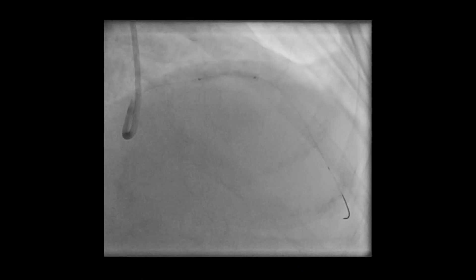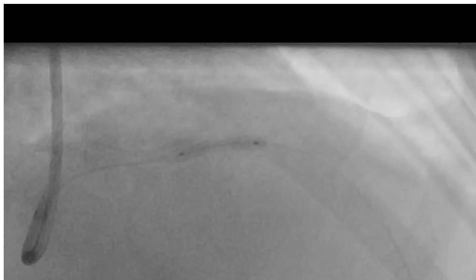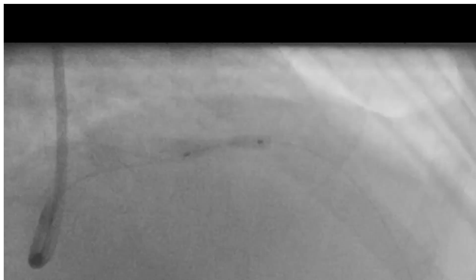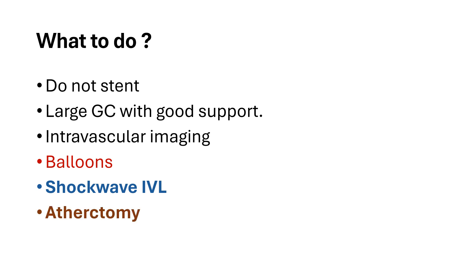Pre-dilatation was done using NC balloon 2.5 by 20, and then 2.75 by 15 to high pressure. There was still waist at the mid-part of the balloon, presenting a balloon undilatable lesion. We have a short video on this topic. In short: it is preferable not to stent immediately; use a large guide catheter with support, intravascular imaging, and then special balloons like cutting balloon, scoring balloon, and possibly shockwave intravascular lithotripsy or atherectomy.